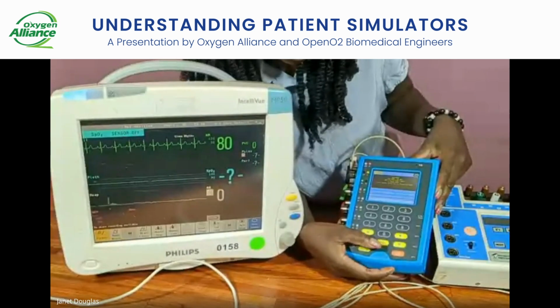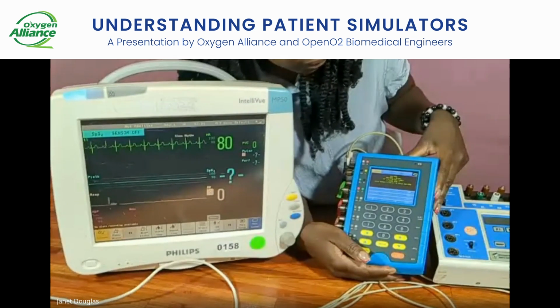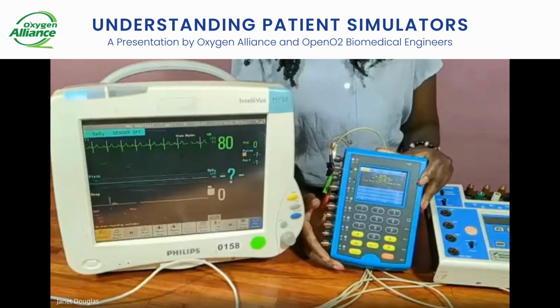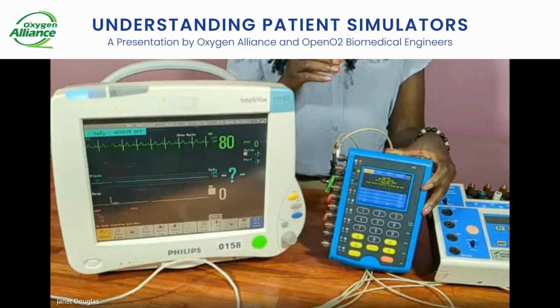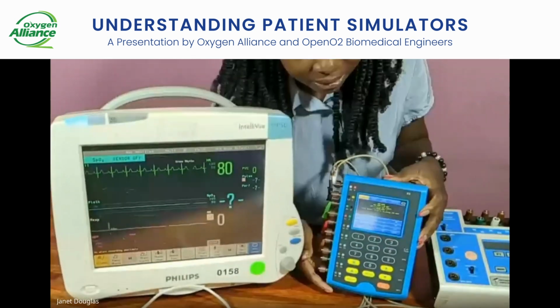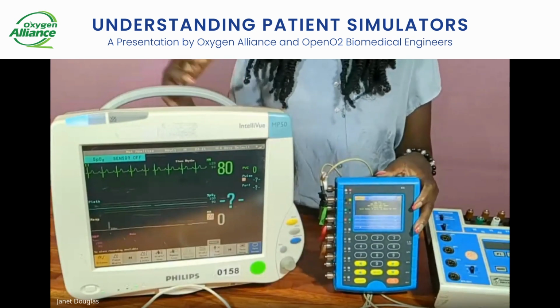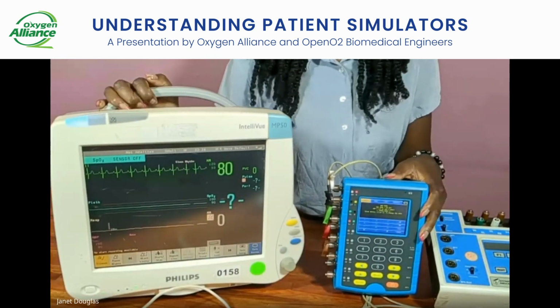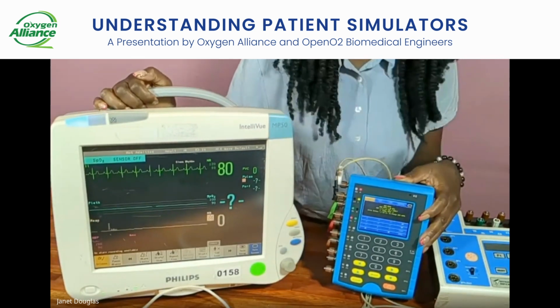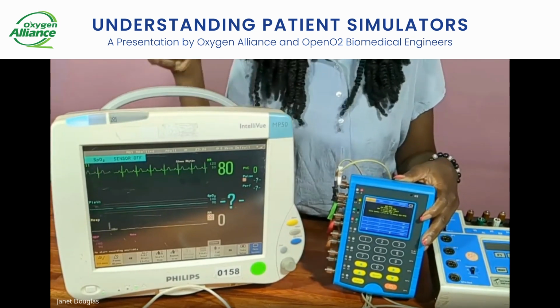So when I click OK or enter, I can now see the ECG rate, which is at 80 beats per minute. So this is the value that is precise, or the one that I had to find even before I adjusted anything. And whatever is said in this simulator is what you're seeing on your patient monitor. So you can see for the heart rate or the ECG rate, it's showing 80 beats per minute on your simulator as well as on your monitor.